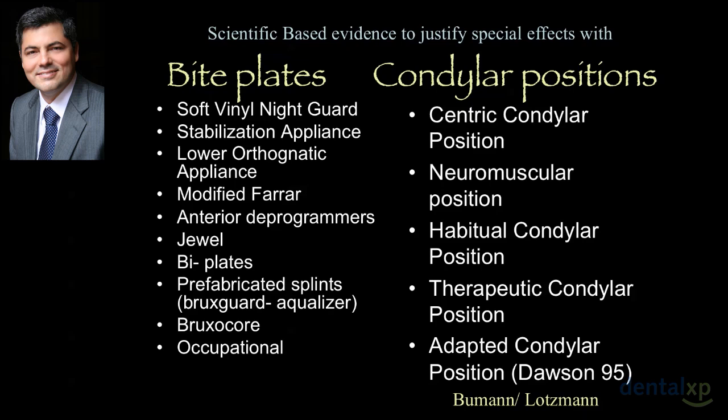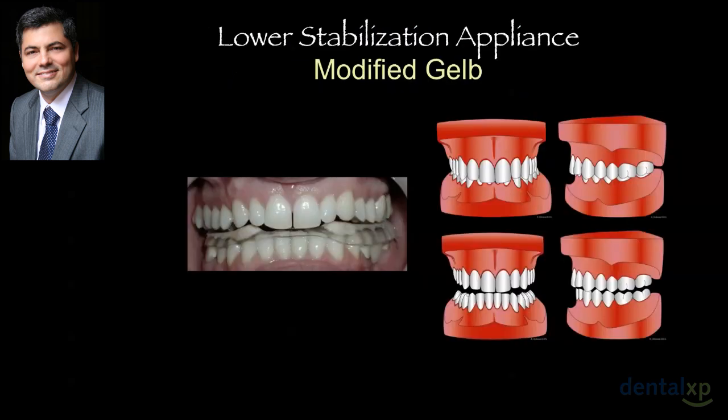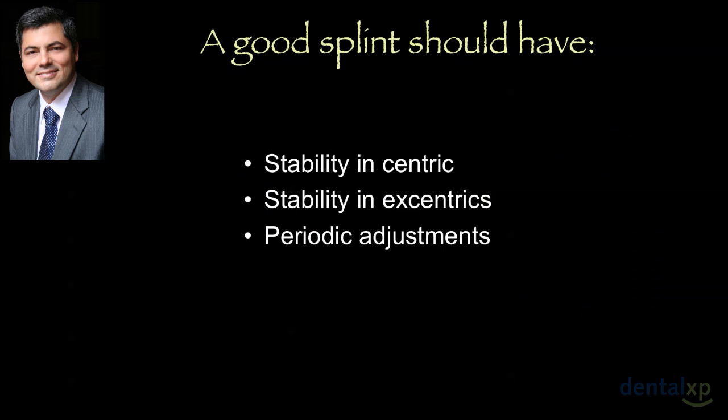You need to become familiar with more than one design, hopefully, and you need to be able to recognize what would be the right modification that the splint would incorporate into this patient's craniomandibular system to be able to have the patient evolve positively. So, the lower stabilization appliance is an excellent appliance that can be utilized to treat symptoms, but also as a protective mechanism. If you feel more comfortable utilizing the standard stabilization appliance, the Tanner appliance or the Michigan appliance, that's a good strategy too, but again, you need to make a decision of why you are using what. But this is just to show you a different type of appliance, and it's important that you understand that there's not just a single appliance there, because most dentists have been trained in specific stabilization appliances. There are so many designs that have been created for different purposes and different reasons.